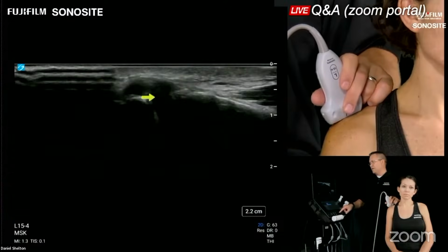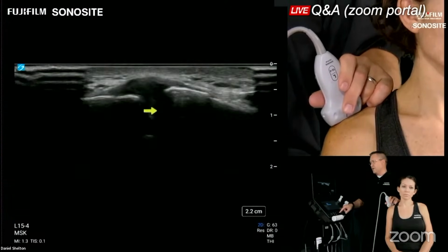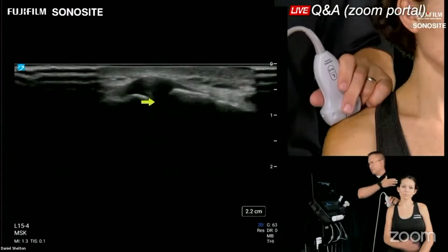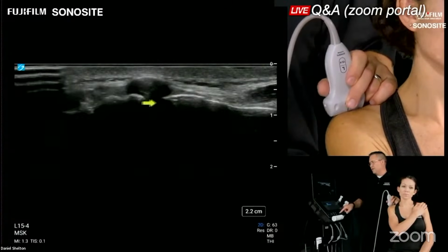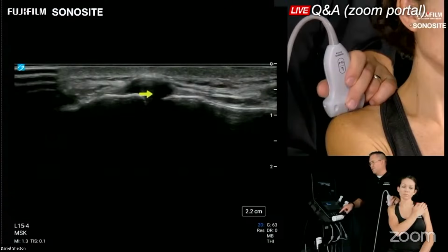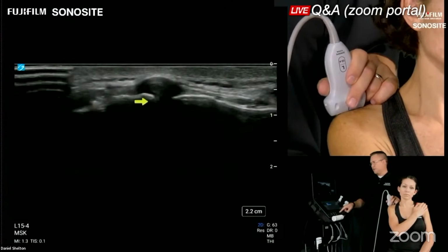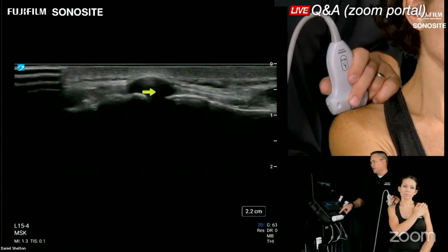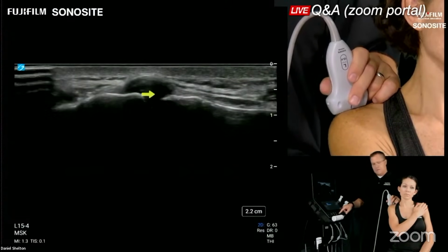So what we're going to do is see if that meniscal homolog inside the joint wants to protrude out with any dynamic motion. So what I'm going to do now is have our patient reach over and touch her opposite shoulder, and let's watch those two bones. Now notice they stayed nice and level. That's normal, that's great. What I don't want to see is either of these bones sublux over the other. I see the AC ligament is perched up high, which is also normal, and the ligament and that meniscal homolog are bunched together. So go ahead and relax.